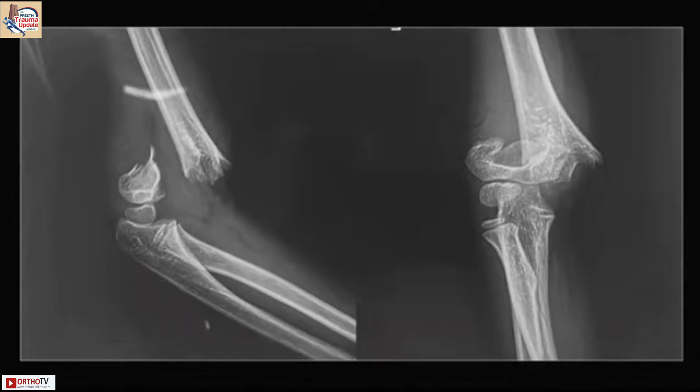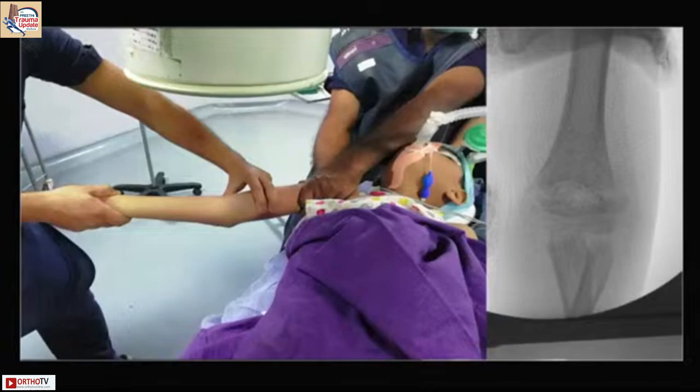Note the fracture pattern, note the comminution, note the line obliquity before you assess the direction of displacement. Once you are satisfied, plan traction in about 20 to 30 degrees of flexion and correct the sagittal plane.